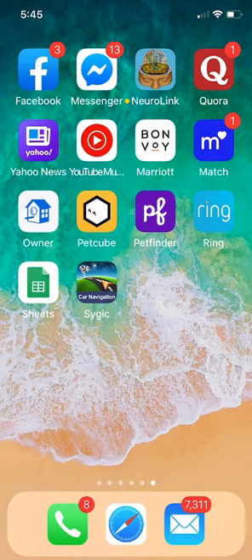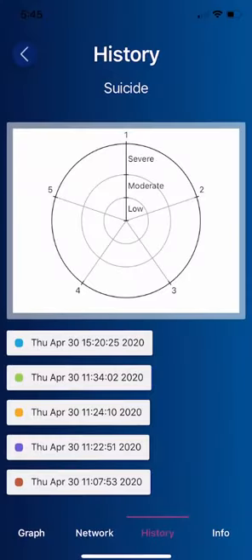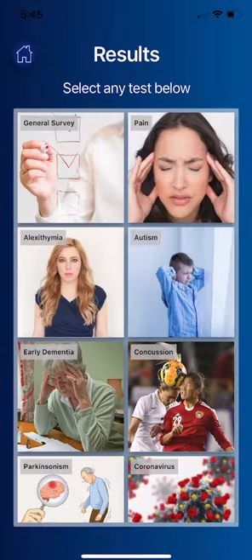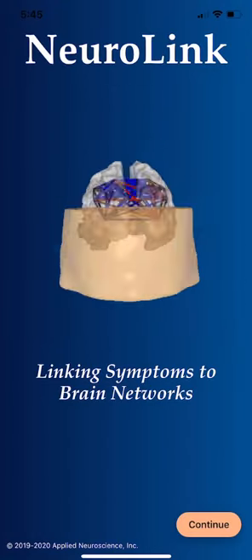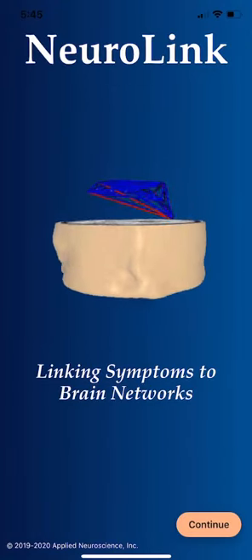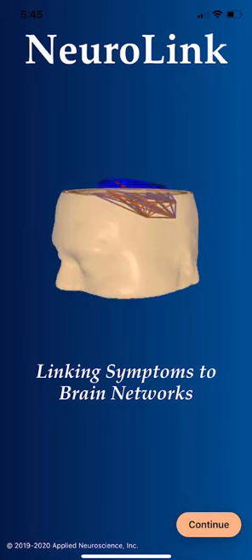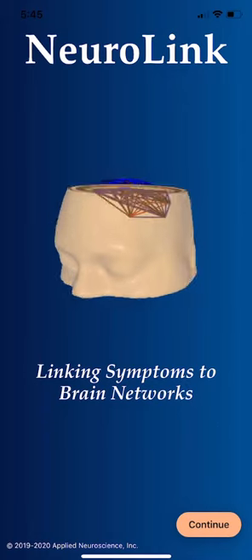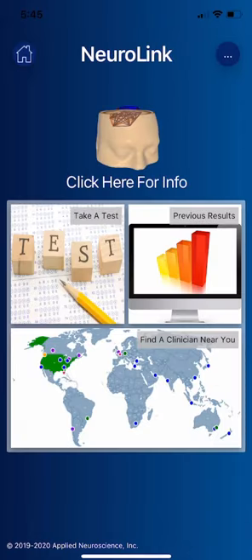After you download it, you click to begin. This is the introductory screen linking symptoms to brain networks for NeuroLink. I'm going to click continue.